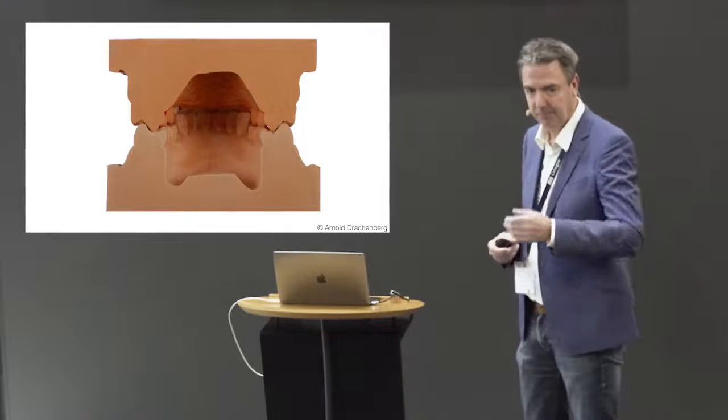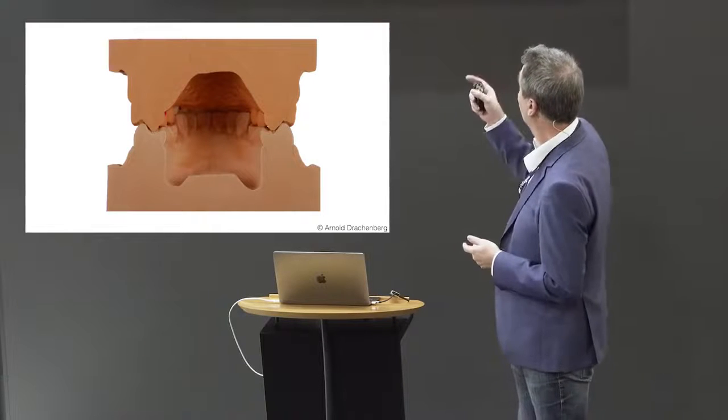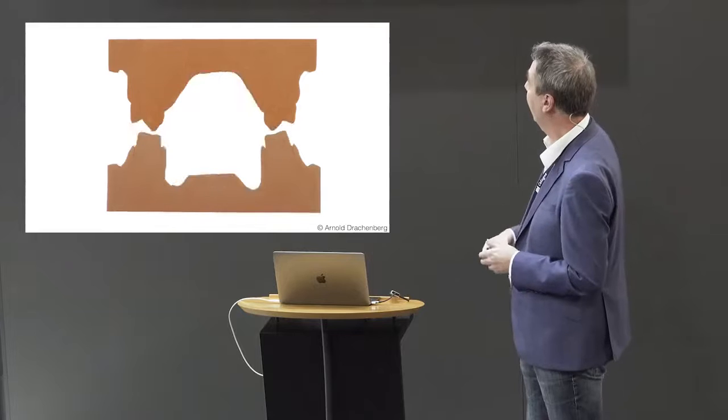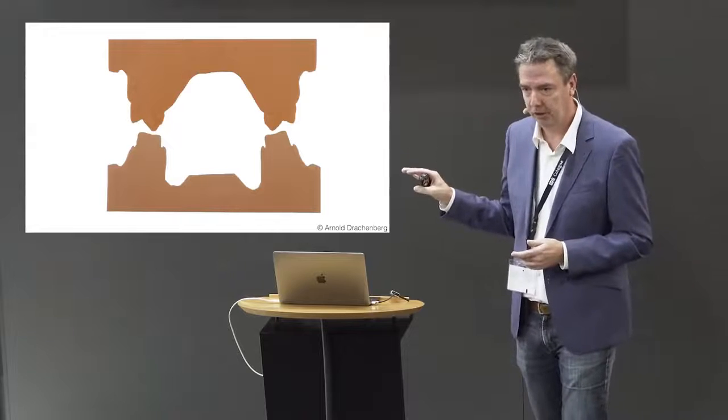So, now let's talk about minimal invasive preparation, because this is my favorite thing in dentistry. I always try to preserve the tooth structure of the patient. I always try to be as minimal invasive as possible. That's a key point. And this is a picture, Jan, you know him very well, from Arnold Drachenberg. This is the situation before we start the preparation, and then this is the prepped case, and if we judge this in the mouth of the patient, it looks perfect.